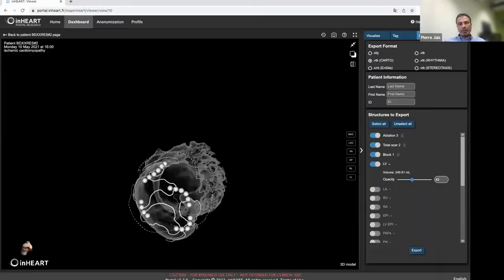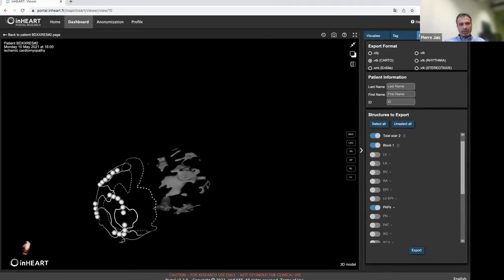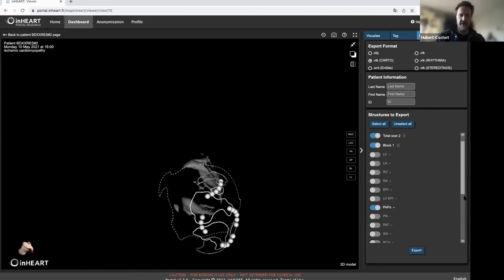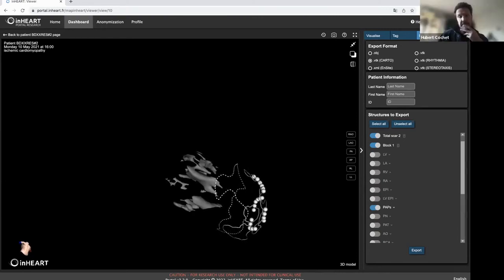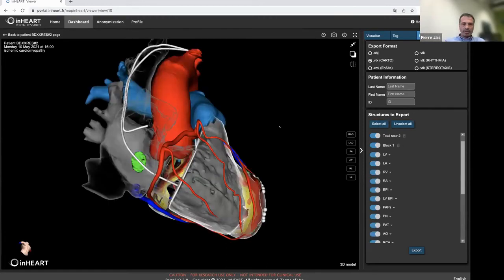Hubert, can you get back to these images? I noticed you had the papillary muscles segmented here. Could you show them to us? I find it quite interesting. Typically, yeah. Well, here it was an apical infarct, so it's not involved in the arrhythmia, but for sure, having these papillary muscles is very, very interesting for multiple cases. Absolutely, I remember cases where it made a difference. It really helped a lot. So I think it's good to see.